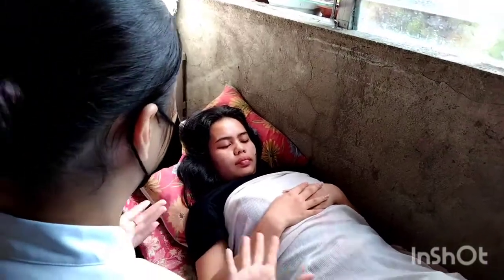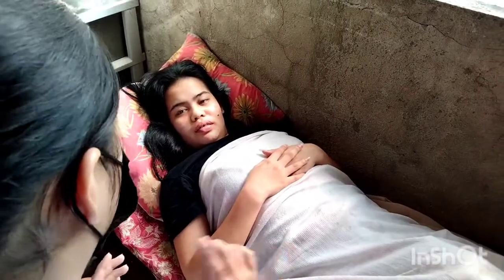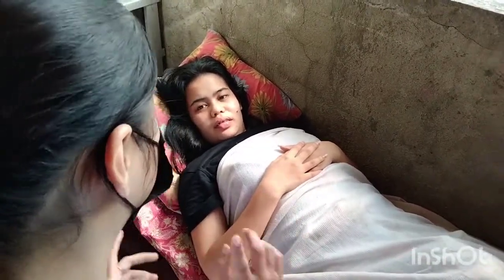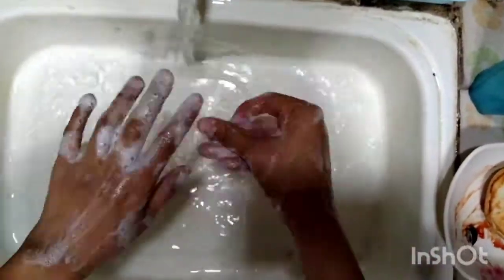Instruct the client on ways to lie in bed with catheter: side lying facing drainage system with catheter and tubing draped over lower thigh, or side lying facing away from system with catheter and tubing extending between the legs. Step number 8 is caution client against pulling on the catheter. This reduces the trauma to urethral meatus. After that, the nurse should wash her hands because this reduces spread of infection.